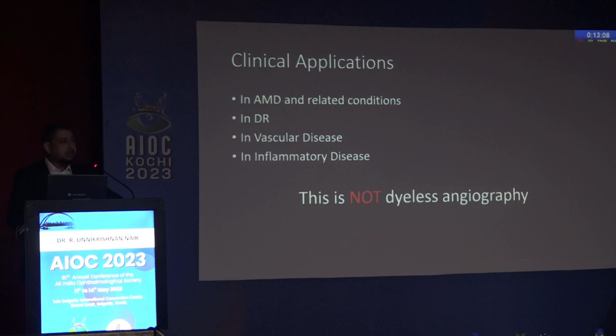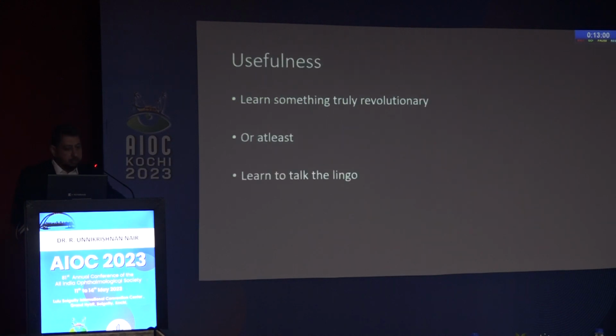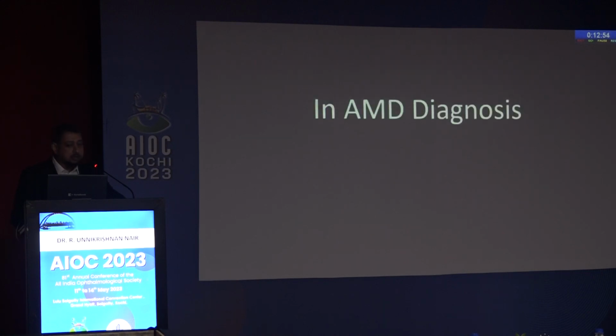And for the clinical applications, we have to say that this is not dye-less angiography. That's the first thing we have to get into. There are whole new brilliant concepts of diagnosis. So today we'll either learn something truly revolutionary or we'll learn how to talk like a retinal surgeon.